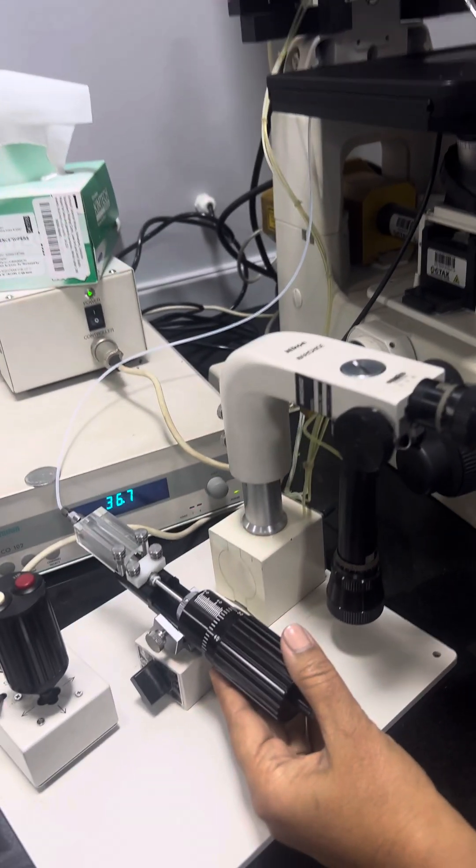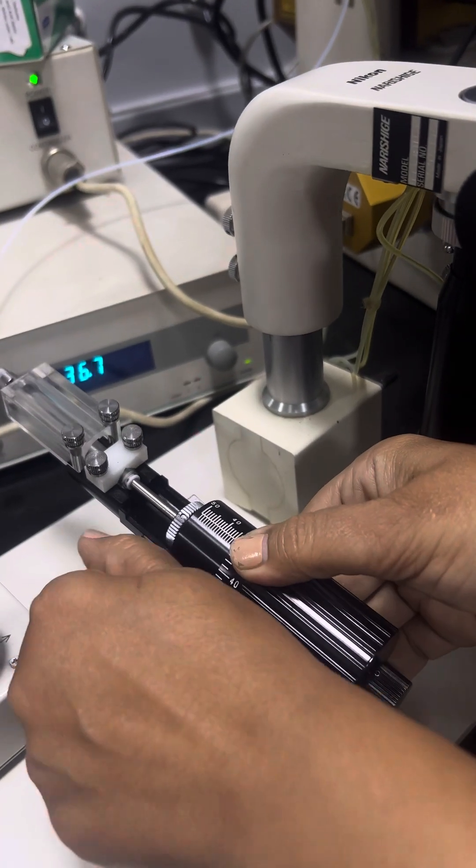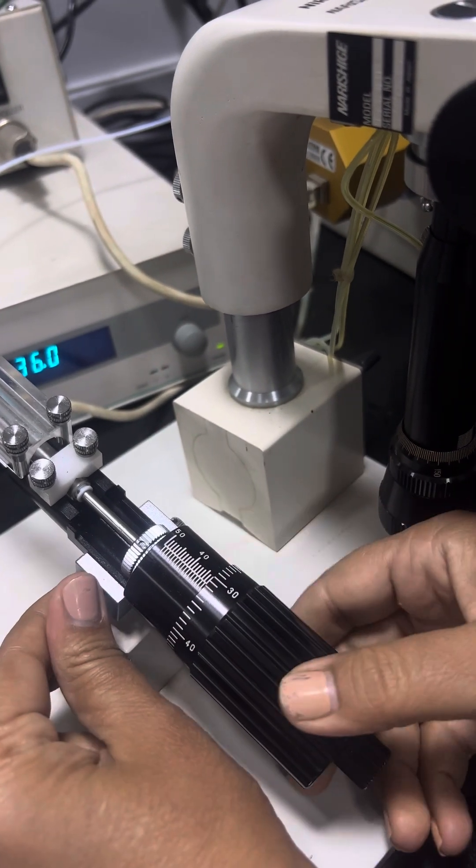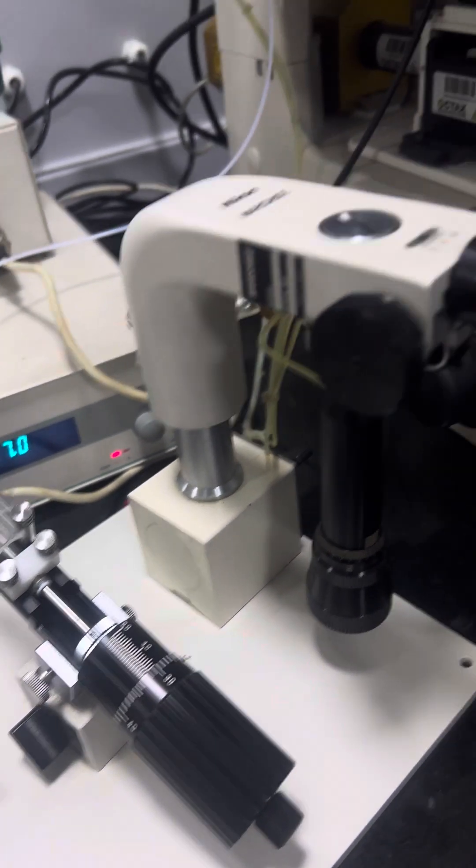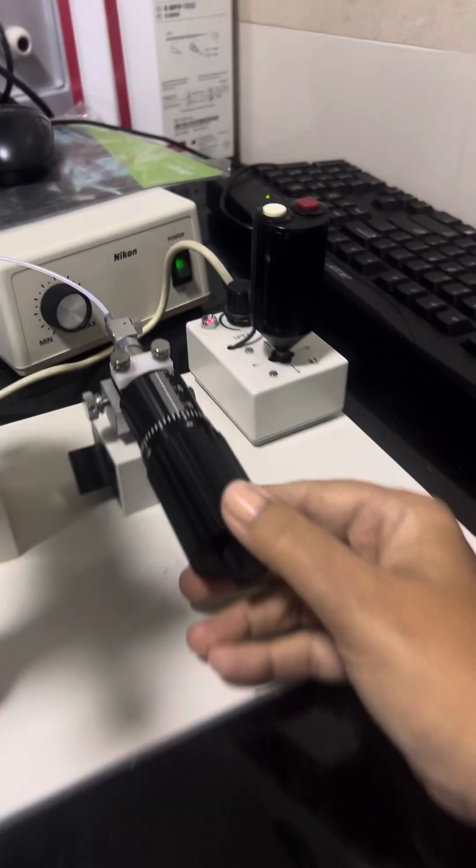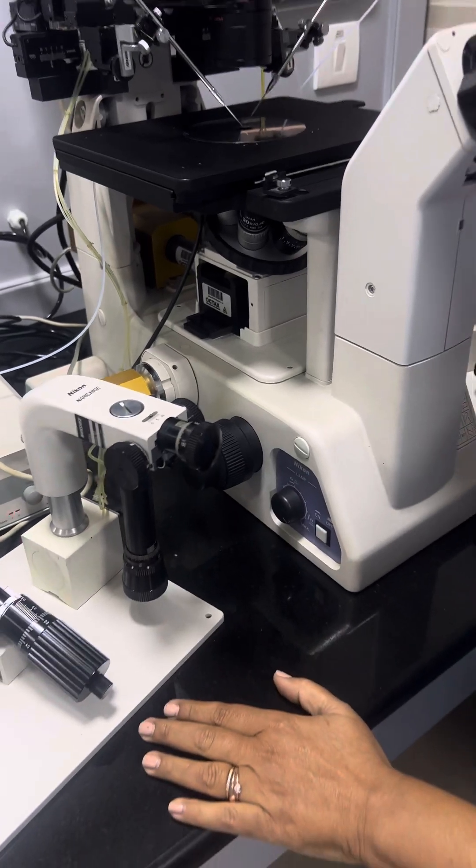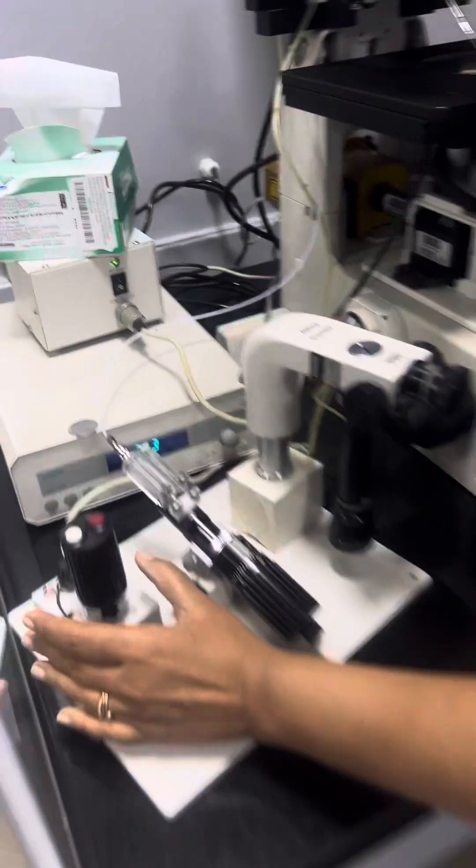This injector should be between 20 to 30. This is the hydraulic one for injection and this is the pneumatic one for holding. I use cross hands. You can use the parallel hands also. And this is the coarse adjustment.